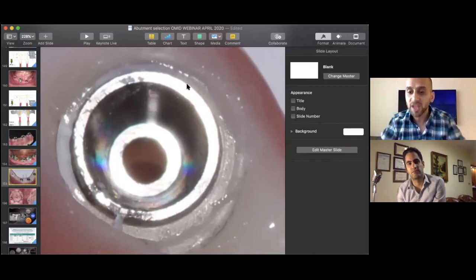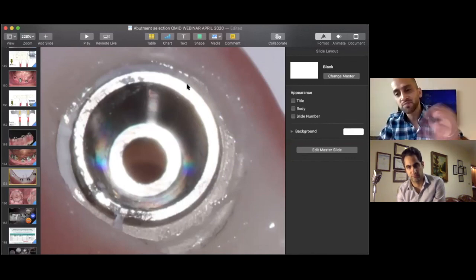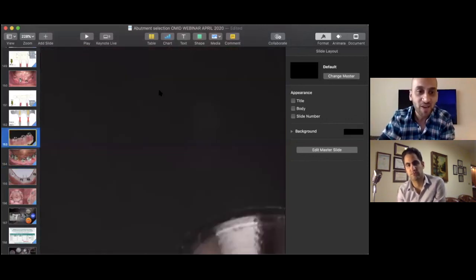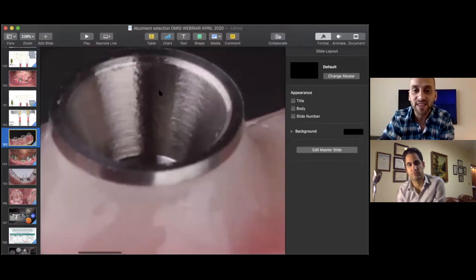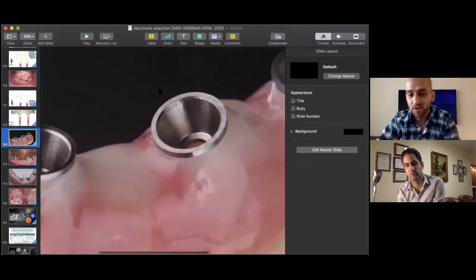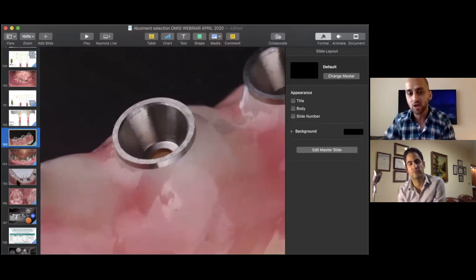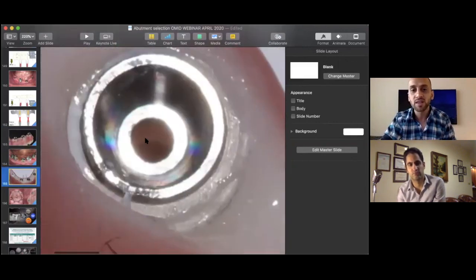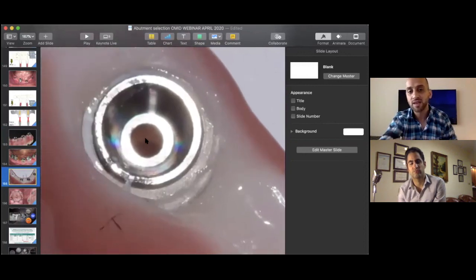So what I suggest for doctors to do, every time you get a full arch prosthesis, before you look at the aesthetics, before you look at the ceramics, turn that sucker around and look down inside and see how pristine that connection is, how clean that connection is. Were they able to give you a connection that looks like this with the passive abutment? Look how clean and pristine that looks as opposed to this over here. So this is a question that we must ask, and look how terrible that looks.